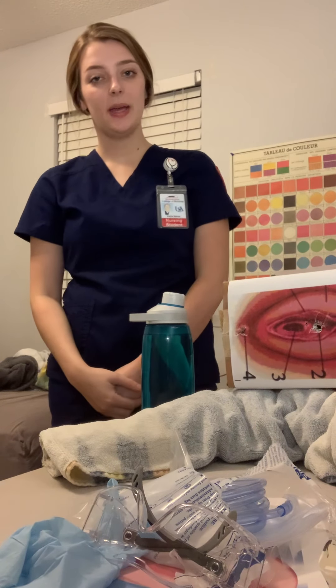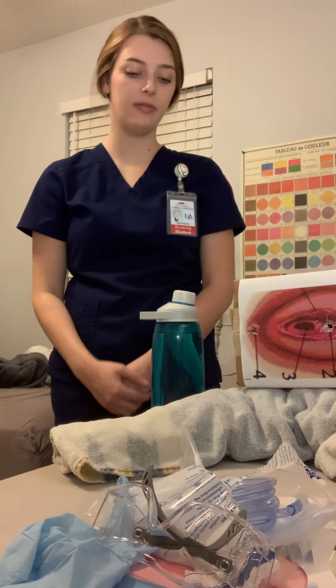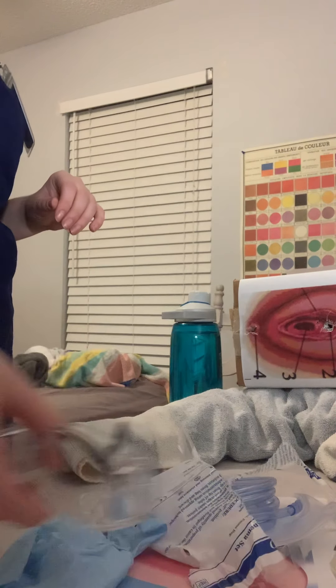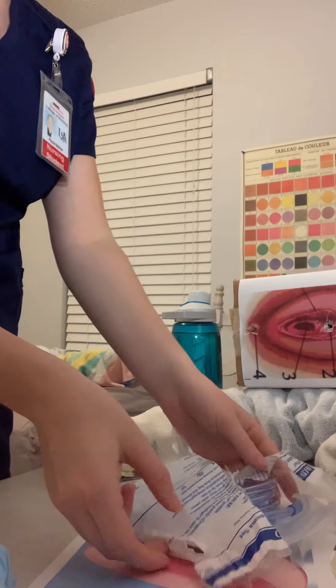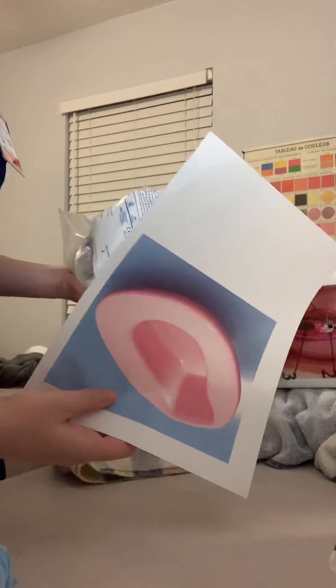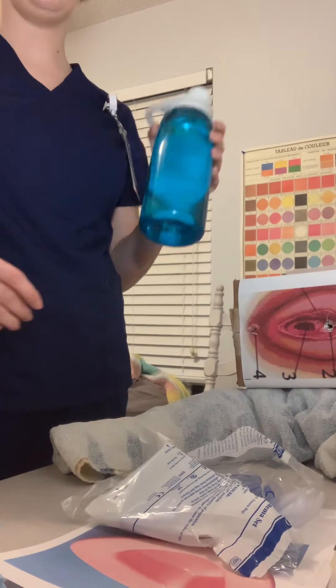Hi, my name is Kayla Spicer and I'll be performing the enema portion of this check-off. To begin, I'm going to gather all of my supplies. I have clean gloves, my enema set, a bed pan, and my water.